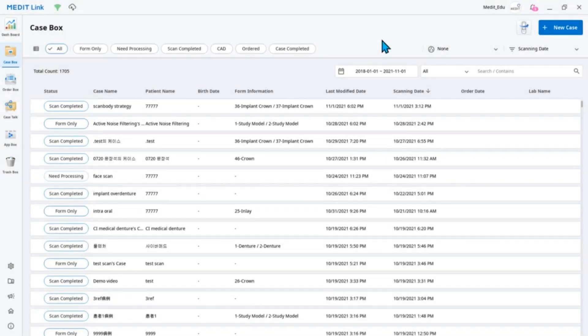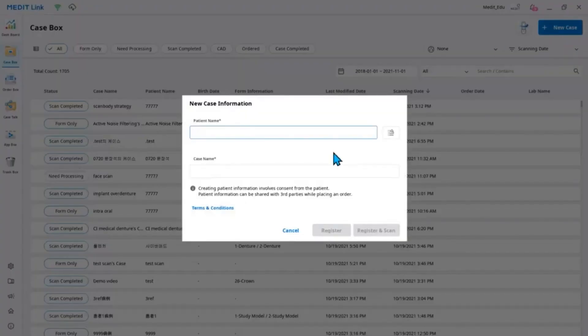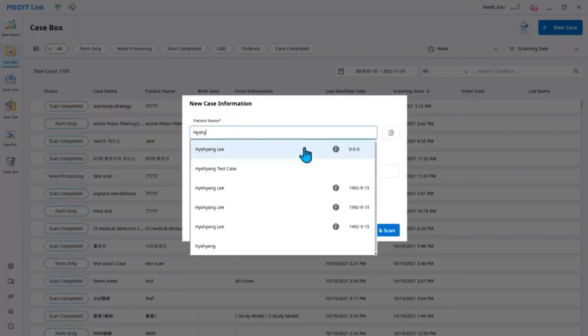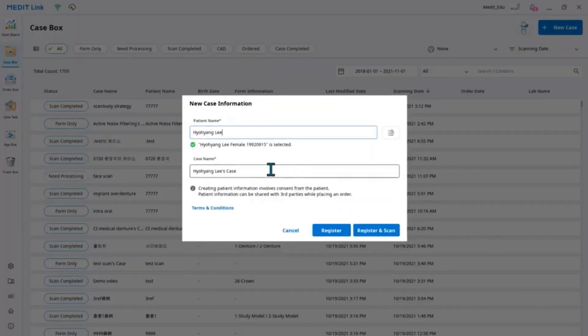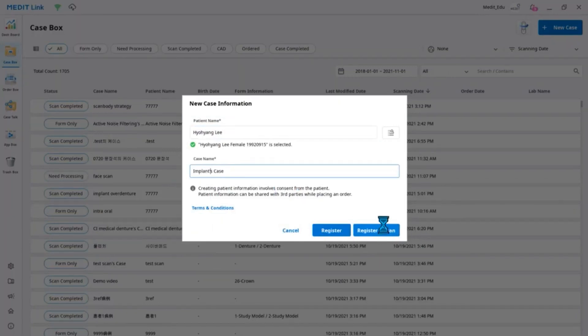In this video, we will be explaining the AI Scan Body Matching feature. The AI Scan Body Matching feature lets you align libraries automatically with the scan body data, allowing you to scan the data quicker.